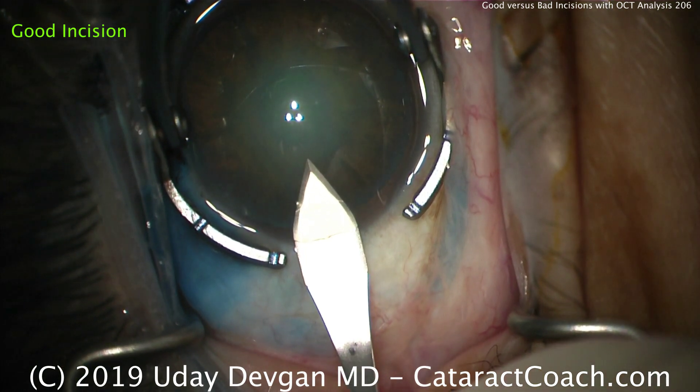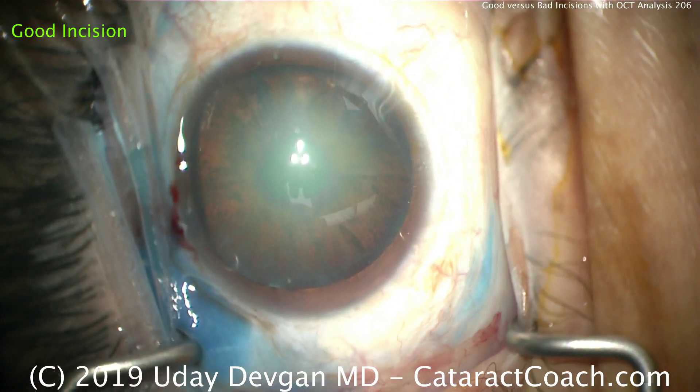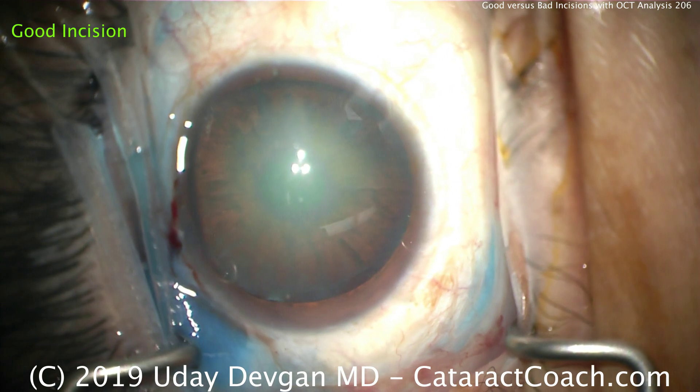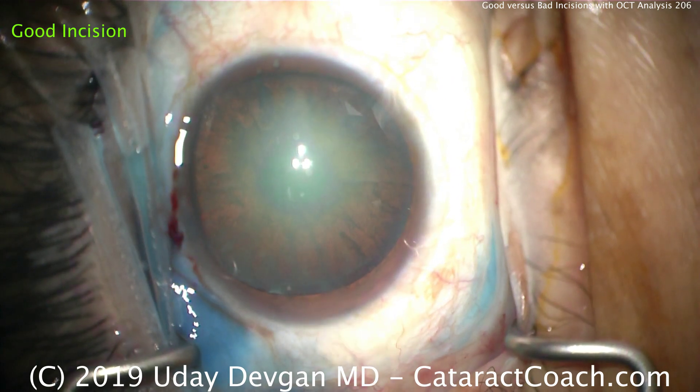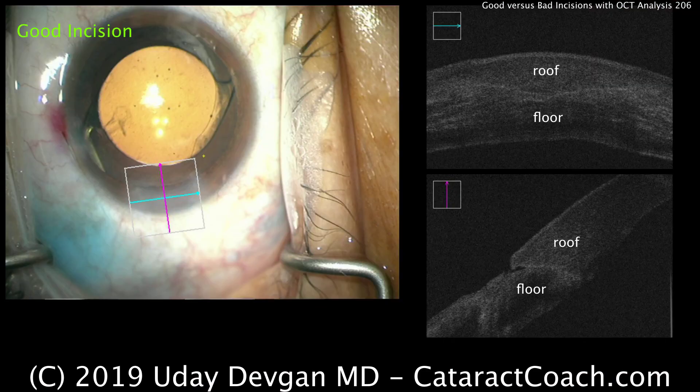There's entering the anterior chamber all the way in and straight out. That was a great incision — it'll seal very well at the end of the case and have minimal astigmatic effect. Let's look at the OCT scan of that exact incision.